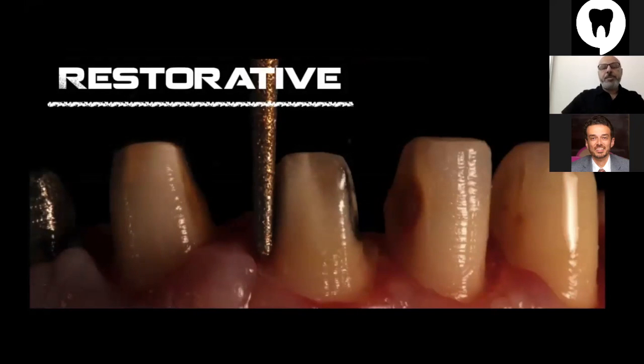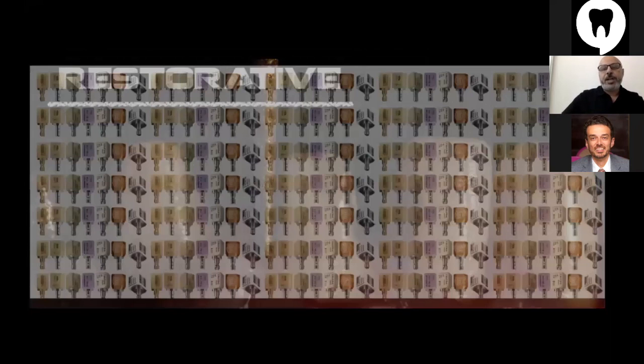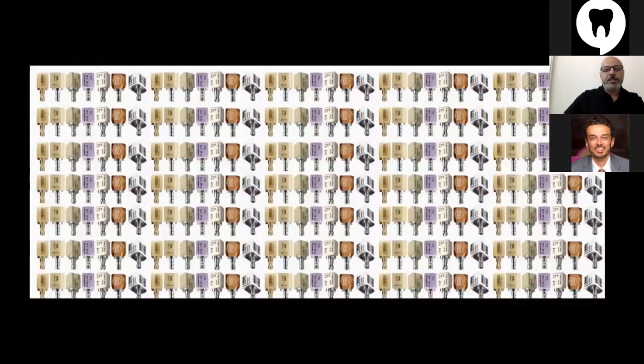Let's talk about the capabilities. Let's talk about what we can do with CAD-CAM in our restorative work, in everyday clinical practice. We have lots of materials nowadays, monolithic materials that we can use directly without layering, without addition of any ceramics or porcelain later on. Of course, you can do that. This is a more advanced phase, but at the end, you can just stick with the monolithic materials.